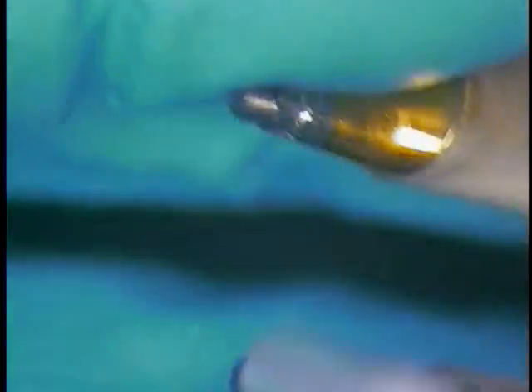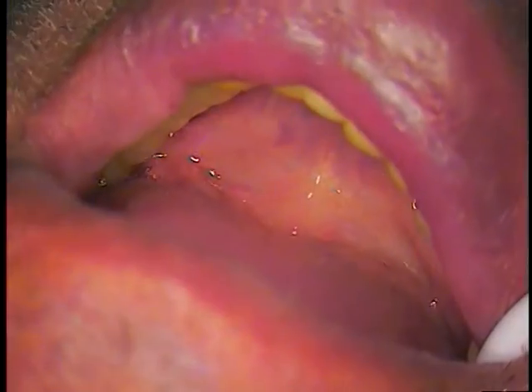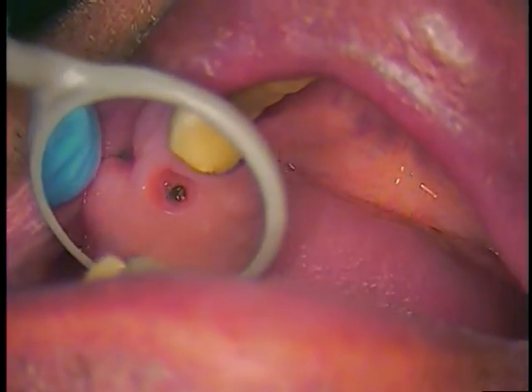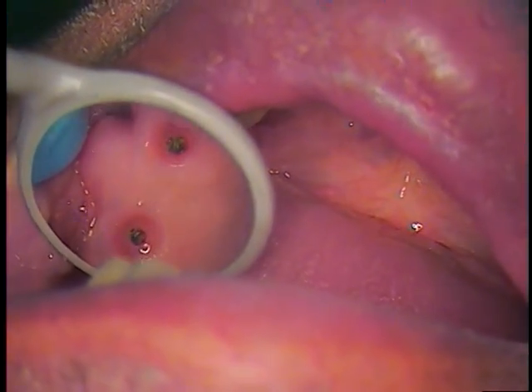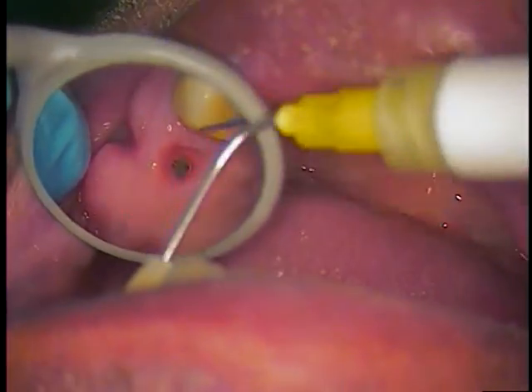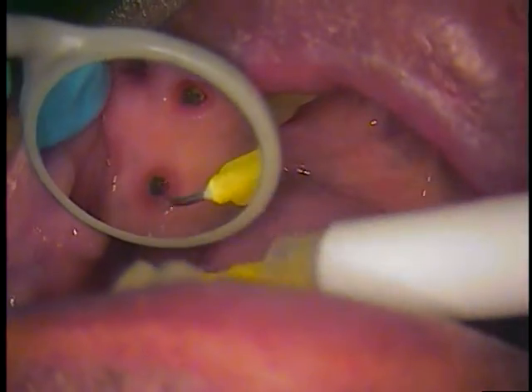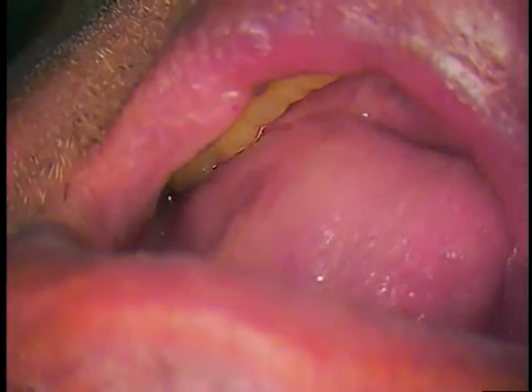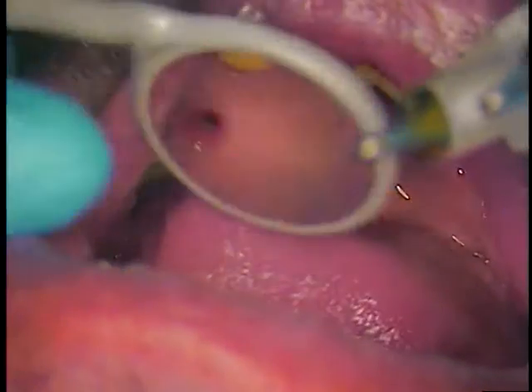You can see the screw's turning on both. Let's take it and just air them. So we're going to go in and out of the mouth and do all the try-in next. I'm just going to verify and recheck. Some microsuction again. You can see how that tissue is starting to relax a little bit — that tissue wants to migrate on its own. So in this goes.